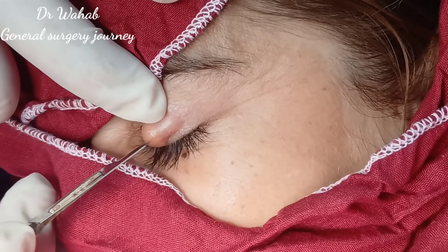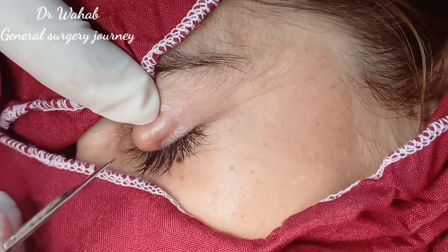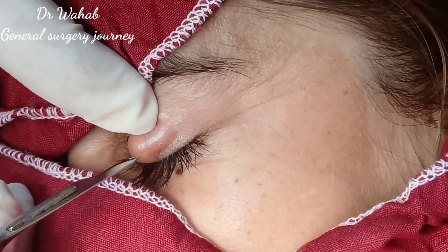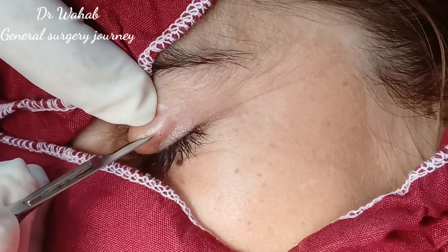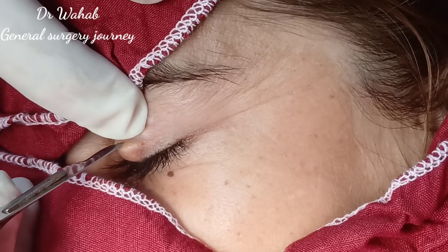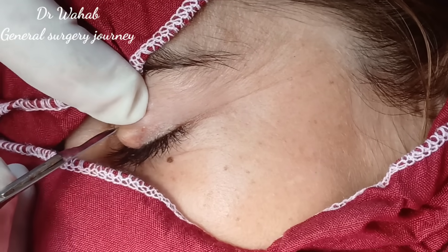Now we will make an elliptical incision directly over the most prominent part of the swelling.